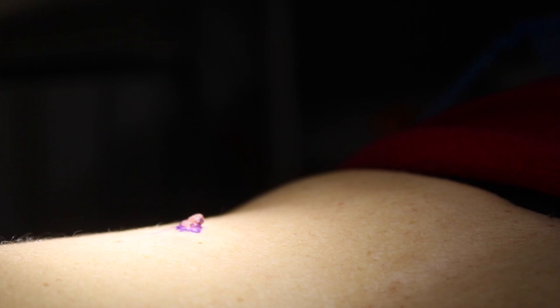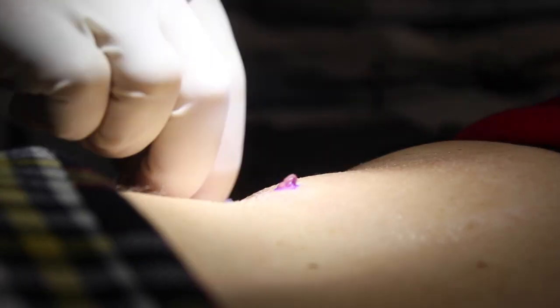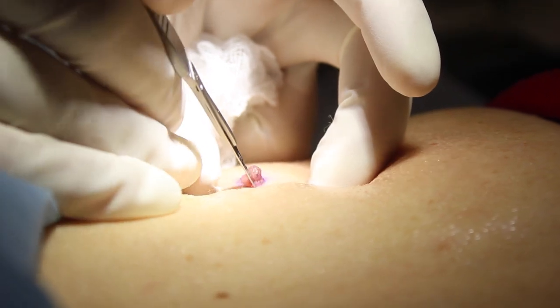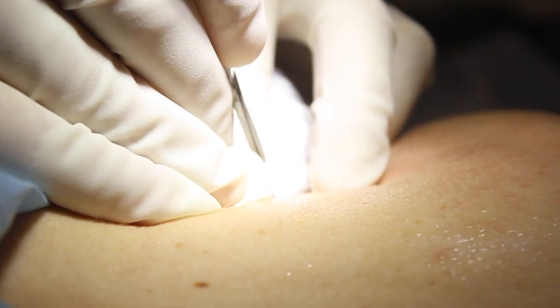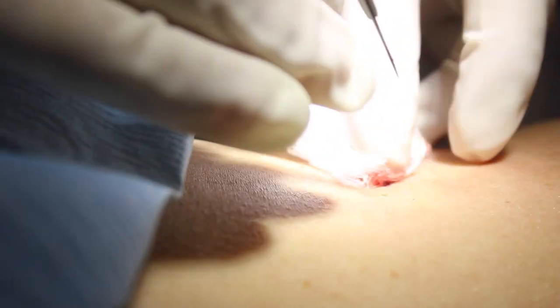This is the back of a lady who has a mole that she doesn't like because it catches on things. I've put some local anesthetic in, made sure the area is numb, and I've made my first incision here around the mole to delineate the edges of the mole.